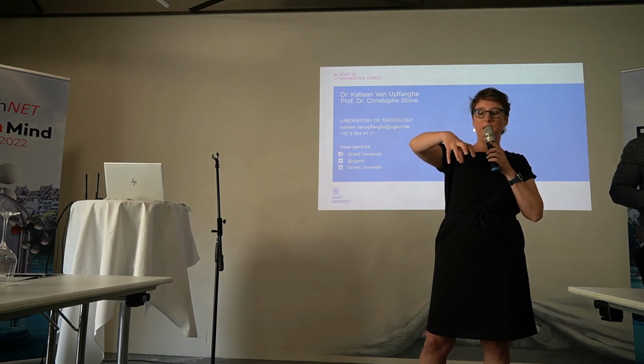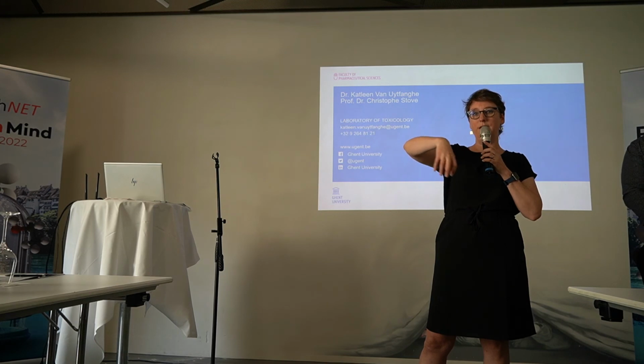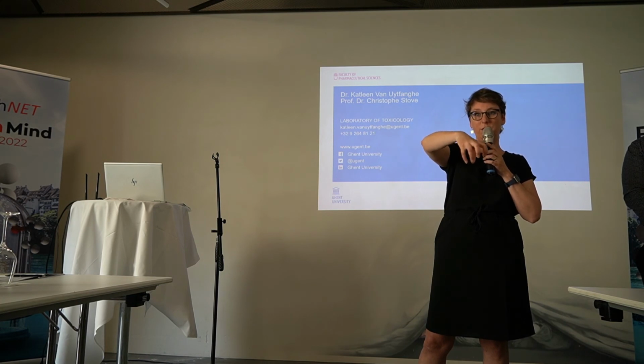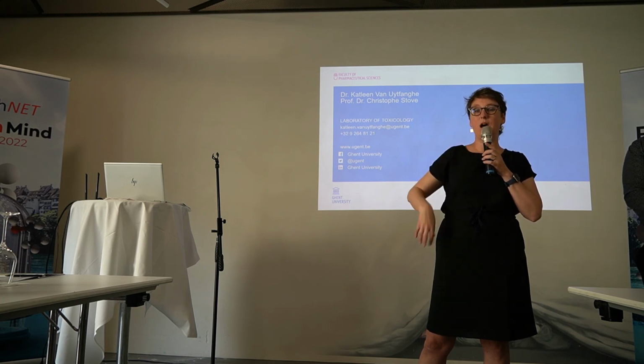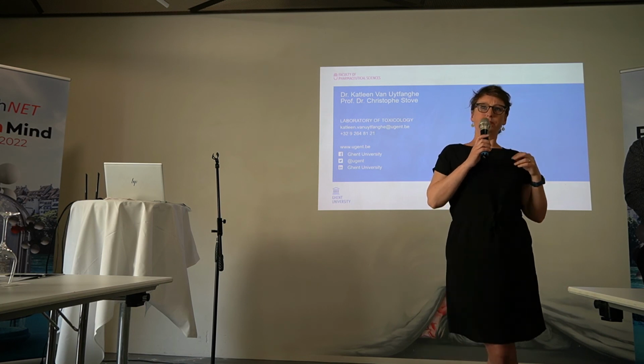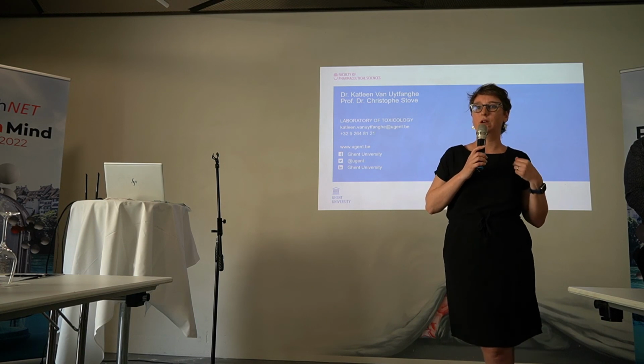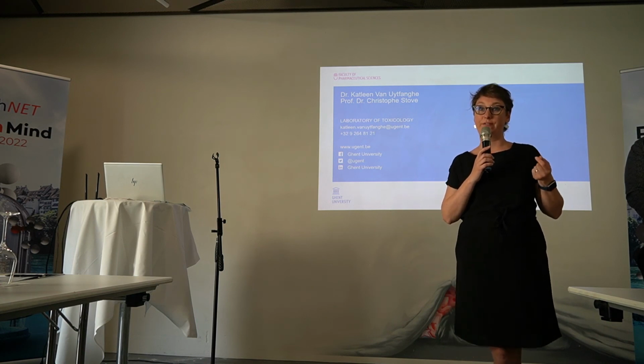So at a local scale they will maybe do a method comparison with all of the Swedish laboratories and they can show that they are in full agreement with each other, that might be sufficient for the Swedish accreditation body. As a reference laboratory, our activities are also accredited according to 17025.